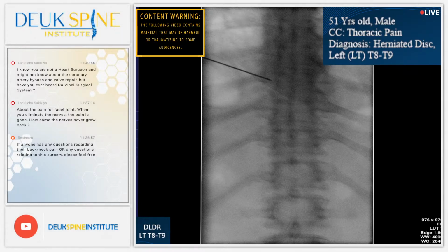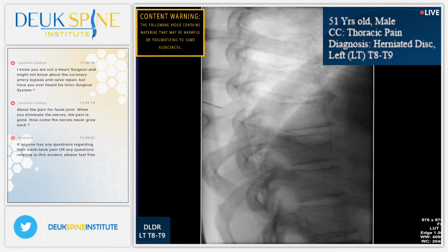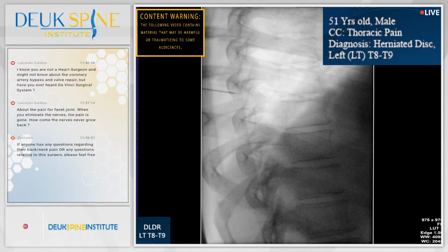Twelve, 11, 10, 9, 8. Well, I'm lined up with the disc. 12, 11, 10, 9, 8, 8-9. That's what we're doing. I'm just not able to get around this. I think you're off on orbits again. I mean, you've got to give me the right orbital picture.